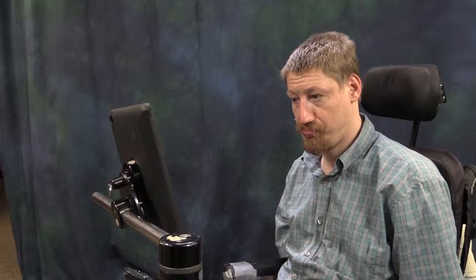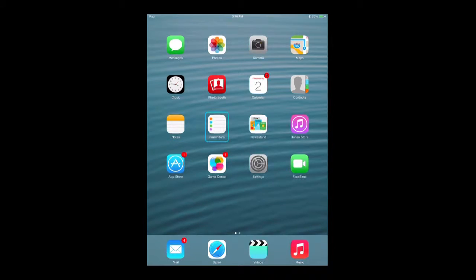My first observation was the sub-menu that comes up when you select an app. This is the scanning menu, which is a little confusing at first. But once you get familiar with it, it's very useful. It has a set of 6 buttons to choose from, like Tap, Home, and Scroll.